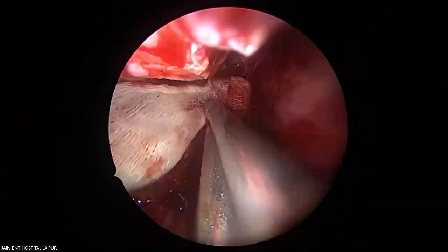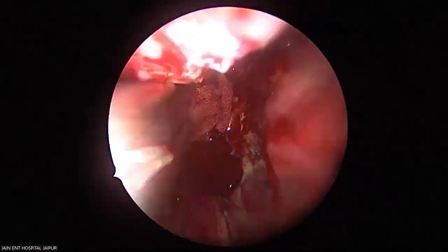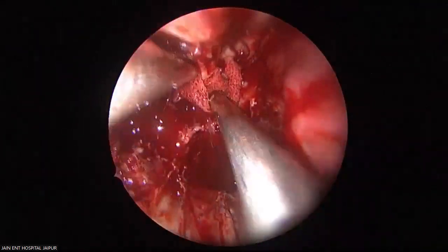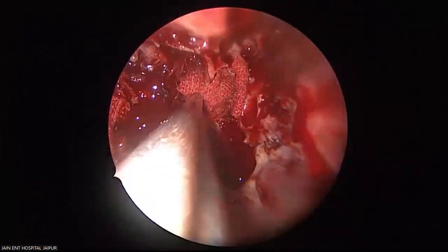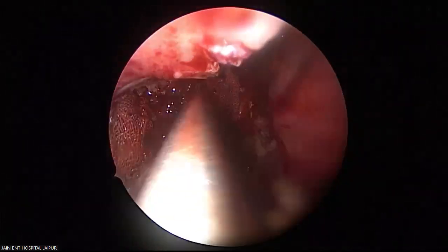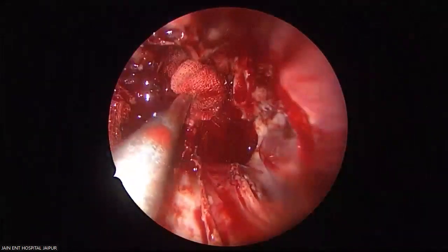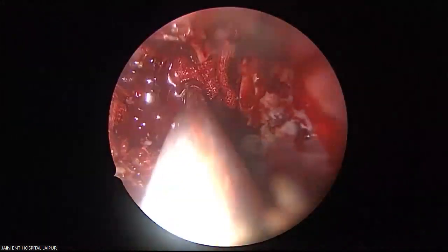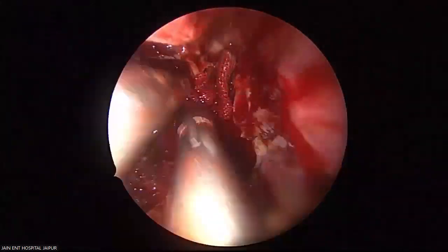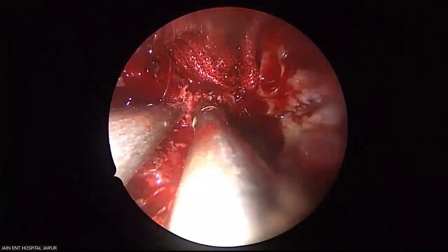See this? This is a very important part. We could easily pull it. I told you, see the lateral component came out so easily. The skull base component came out so easily. All these extensions which are frightening you, believe me, are not difficult to remove. Now the pterygoid component, the huge pterygoid component, see the tumor there.